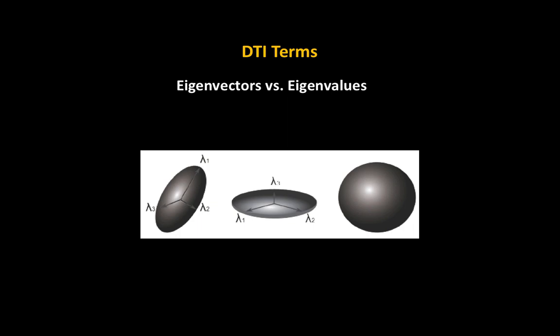So if there was no preferred diffusion along any of the directions, it would be best modeled by a sphere, indicating that there's no preferred direction of diffusion. Now, in the brain, and specifically in the white matter tracts, along these axons, they're like tubes, right? It's like a garden hose, and obviously the water is going to be preferentially going along one part of the tube. Now, with axons, it's a little bit different because we're assuming that it's basically just randomly diffusing. But if you constrict the direction that it can diffuse, it's going to preferentially go along the direction of those boundaries.